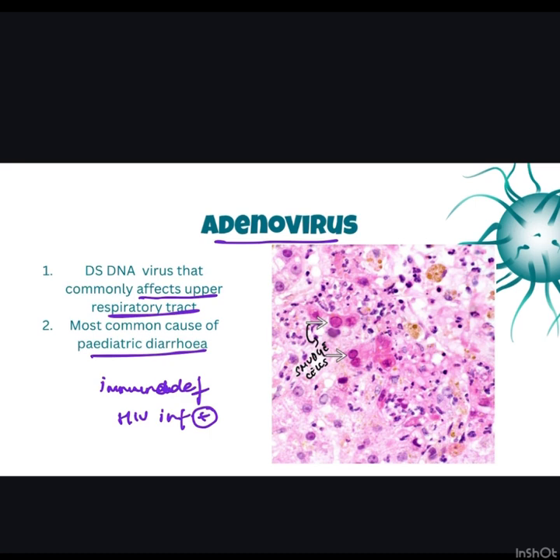So on microscopy, the surface epithelial cells, that is the goblet cells, are usually infected. So it most commonly affects the goblet cells. And here you basically have Cowdry type B nuclear inclusions which have enlarged, homogeneous, smudgy nuclei. So basically you have smudge cells because they have smudgy basophilic nuclei as labeled here.